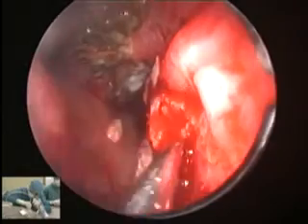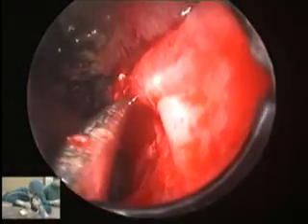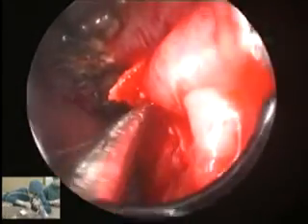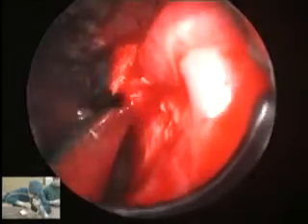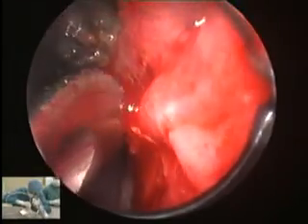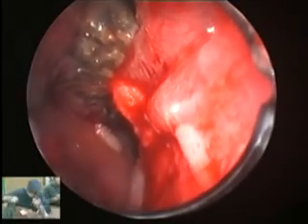Sham, we see you operating down this telescope rather than off the screen. I'm still not used to that method. How's your neck? Seems all right at the moment. We'll ask again at the end of the operation.